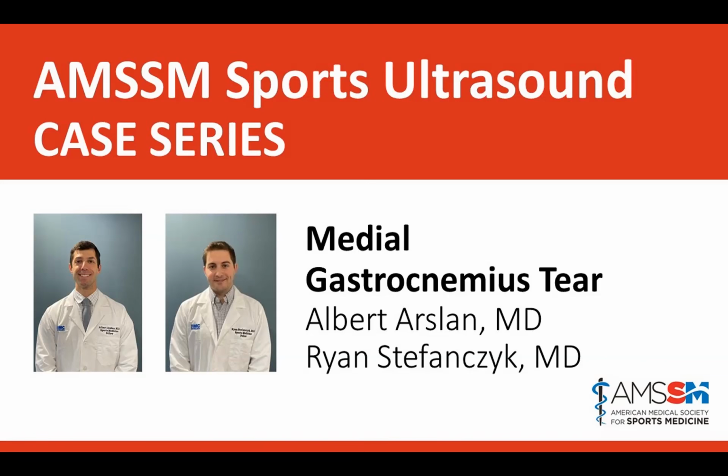Honestly, if I see a fair amount of fluid and not a lot of just scar tissue, what I will do is I'll use some lidocaine and some saline, and I'll try and lavage it and just loosen it up with a little bit of free fluid. Similar to how you would barbotage a calcific tendon, I'll quote unquote barbotage this coagulated blood, and I'll try and get as much of it out as I can. Really what you want is you want these surfaces back in opposition so they can form collagen bridges and start that healing process.